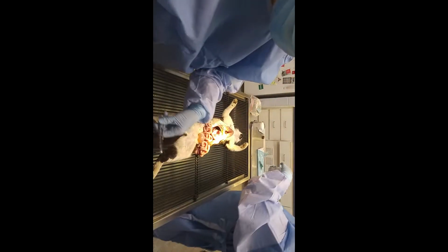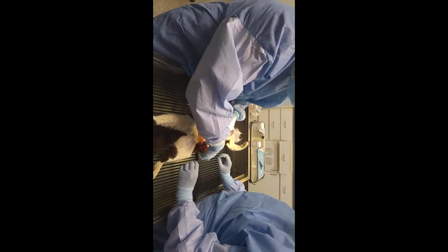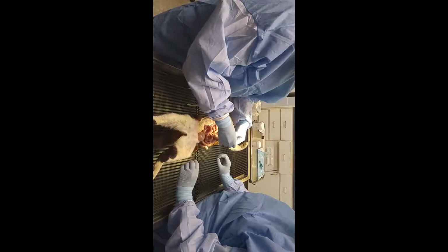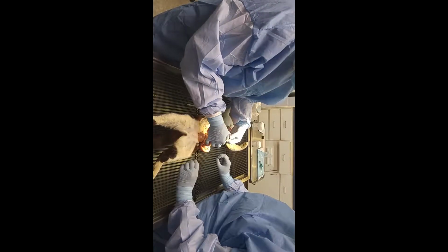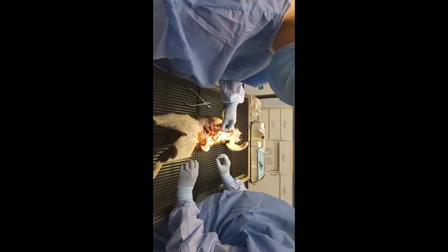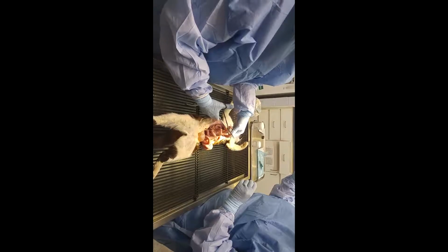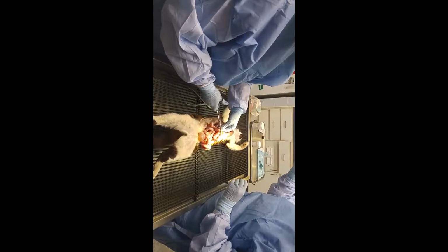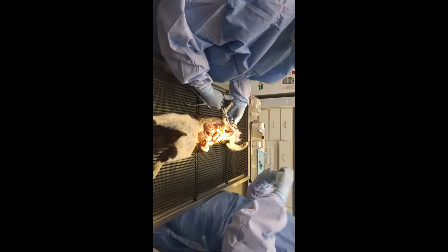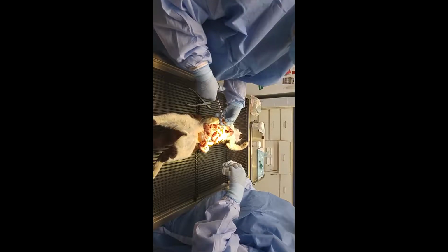Okay. And then when we're done, we'll appropriately label that as pancreas. Pancreas. And now we're going to actually look, since these intestinal loops feel so thickened. We'll actually get a piece of small intestine here, which might actually cause us to have some oozing, of course. And I'm actually going to open the lumen just to take a look on the inside.